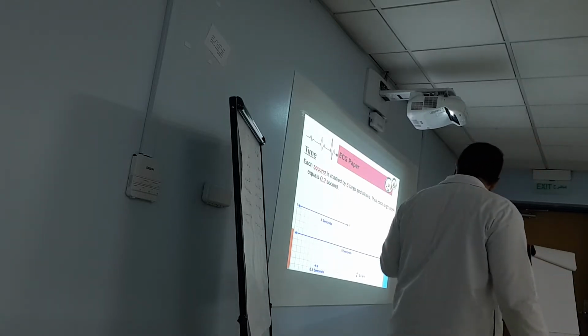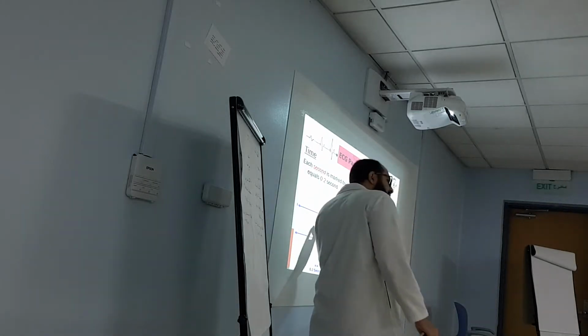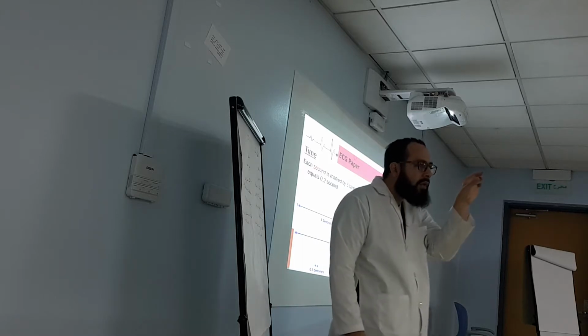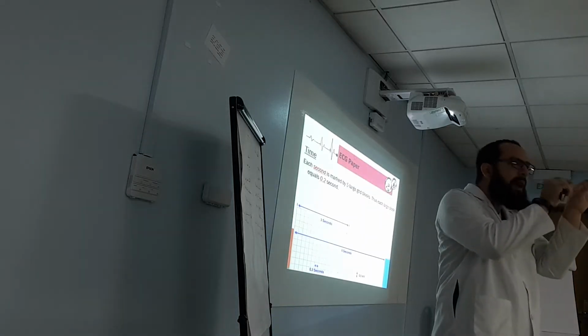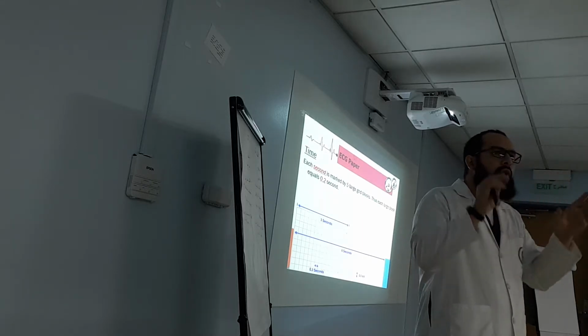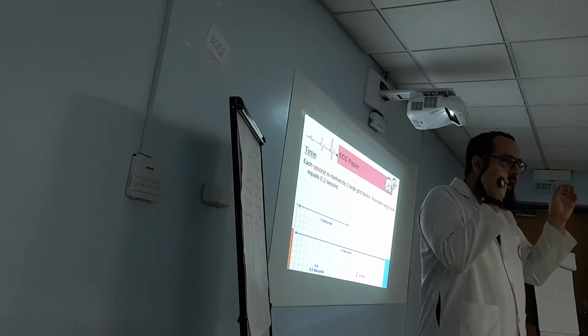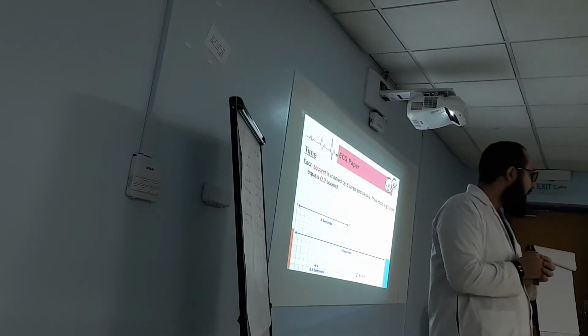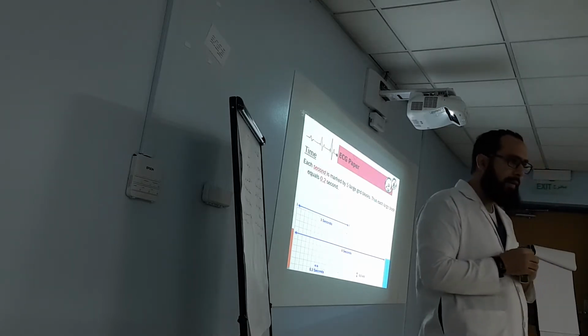Why is it important? Because my ECG waves are small. So this wave takes 3 small squares. So 0.04 plus 0.04 plus 0.04. So you measure the length of the waves, or how much time the wave takes, in these small squares. Okay.